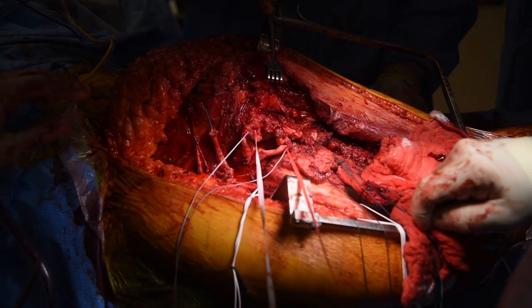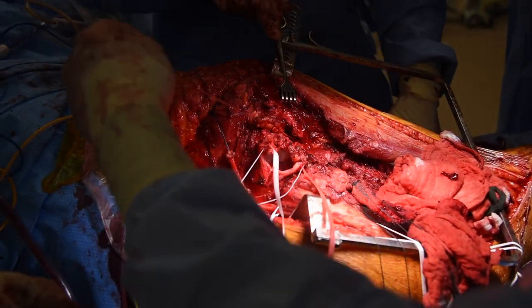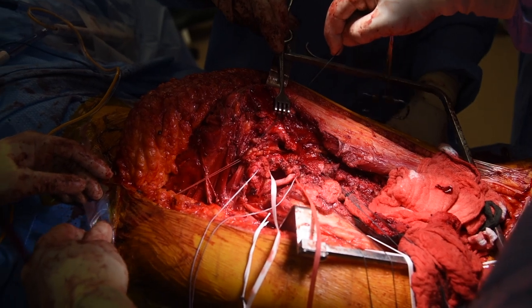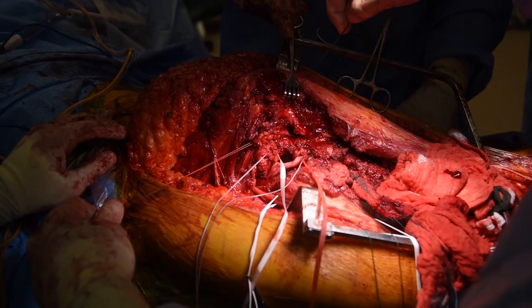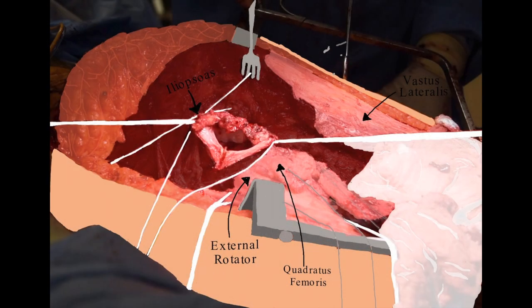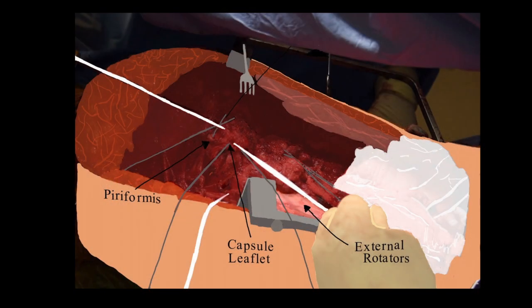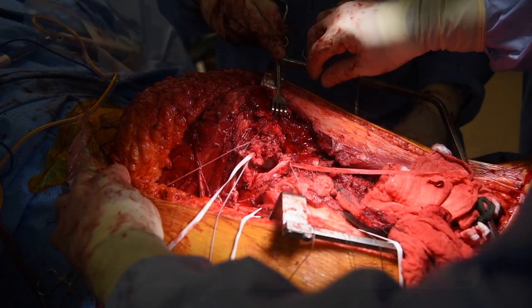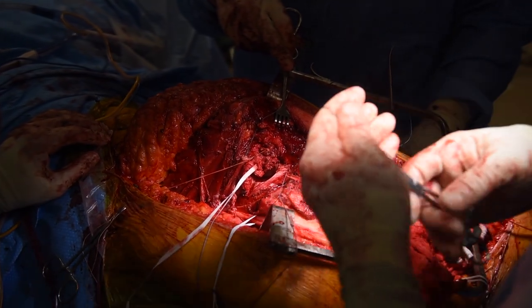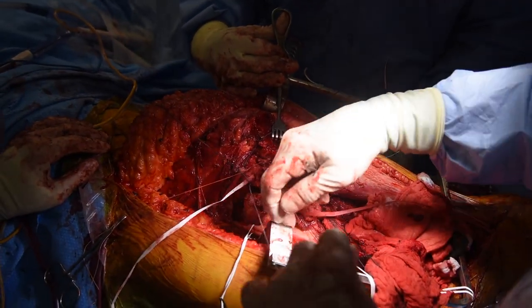This is our iliopsoas muscle; we have released that and opened up the joint capsule anteriorly. We will transfer it over to the piriformis muscle, where they will meet and overlap to help reinforce the joint capsule proximally and posteriorly. This is the hip joint capsule with two heavy non-absorbable sutures through it, where the prosthesis will be relocated and tied around the neck in a purse string manner. We will then transfer the iliopsoas to the piriformis, have the external rotators come up to help reinforce the other repairs, close and reconstruct the capsule area, and prevent dislocation posteriorly.